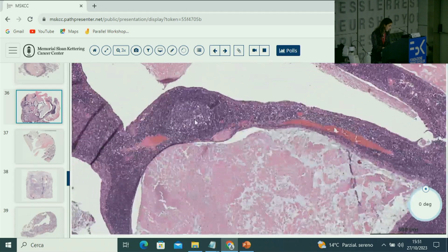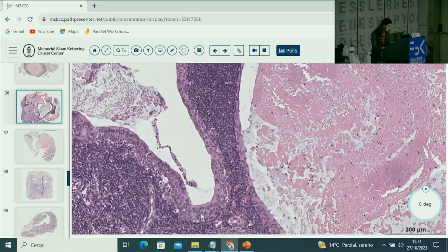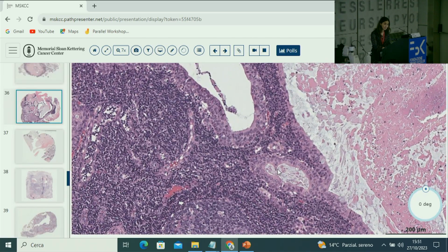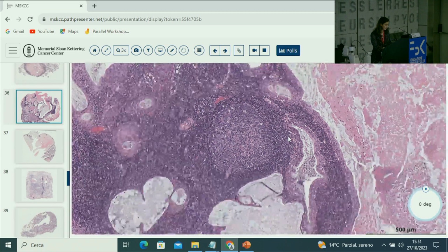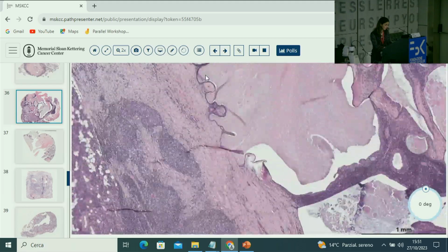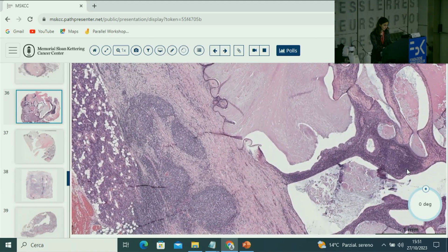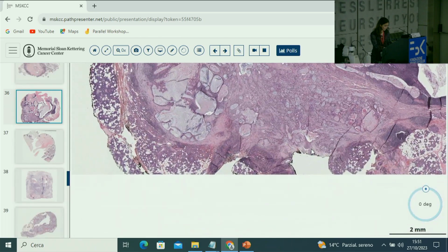And as I said, I usually look around to see when we see more stratification or more solid areas like this. You don't usually see glands with protrusion from the cyst. This is more characteristic, or suggestive at least, of mucoepidermoid carcinoma. When you have the resection, areas like these are very helpful. And even here, I think this has a more typical area.